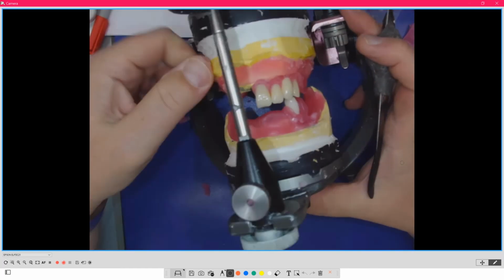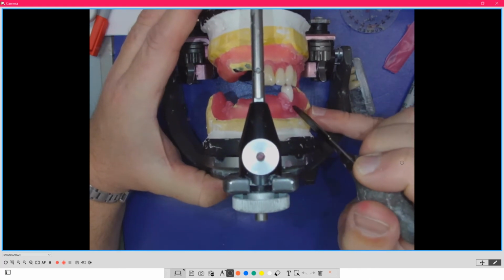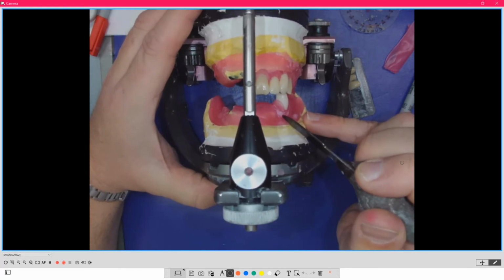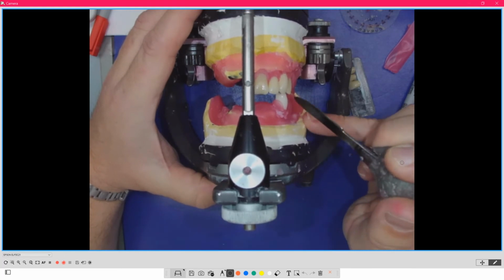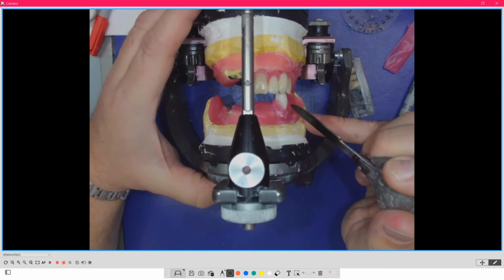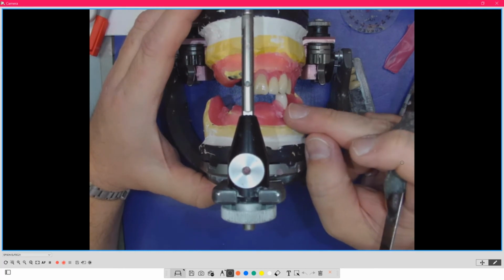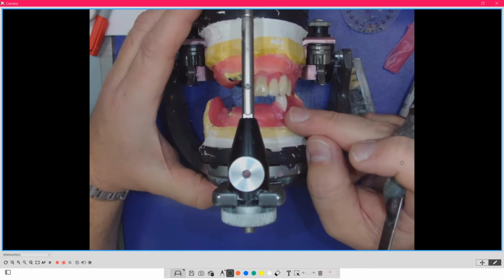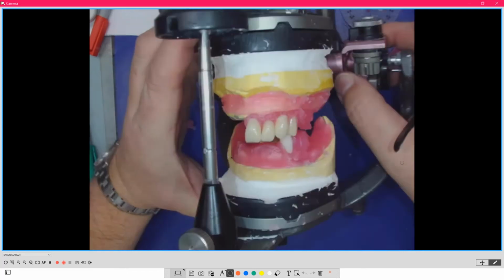But if I look at it head on, what are you seeing because of the class 2 is that I'm kind of floating this tooth a little bit, and I'm a little bit off the ridge. But I'm more worried because class 2s typically can have a tighter jawline and a tighter lip line, meaning that their lips are tighter because of the structure and the way the muscle lines are on the curvature. I'm going to run into the problem of the cheek hitting the denture because it's a little bit thick, and it's going to be popping it out when they yawn, when they laugh, or even during the chew cycle. So this allows me freedom.